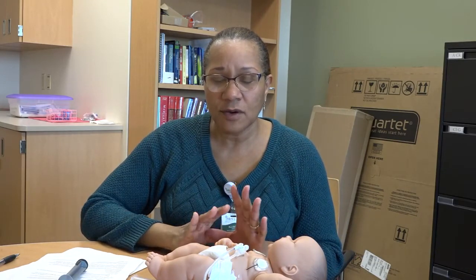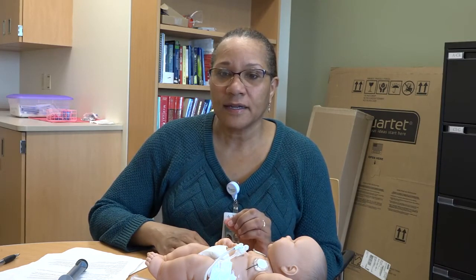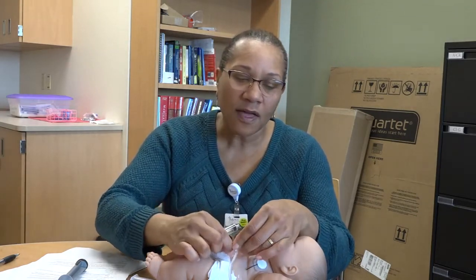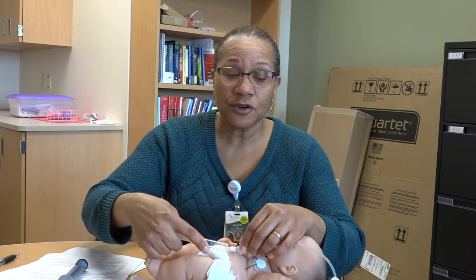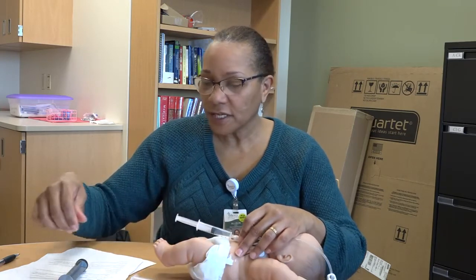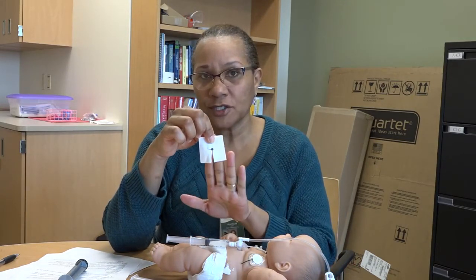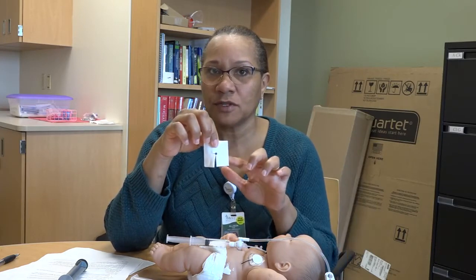So now I want to talk about some minor complications that will need minimal or even no interventions. Parents seem to be most concerned about leakage from the G-tube site. And as I shared with you before, that is a hole that we've created, and with the balloon that sits against the stomach wall, that does keep a lot of leakage from happening, but you're still going to see some. Whatever leakage you notice on your 2x2, as long as your 2x2 is handling whatever leakage, then that's appropriate. You're not having necessarily too much leakage if your 2x2 can handle it.